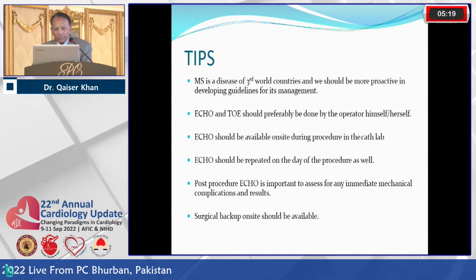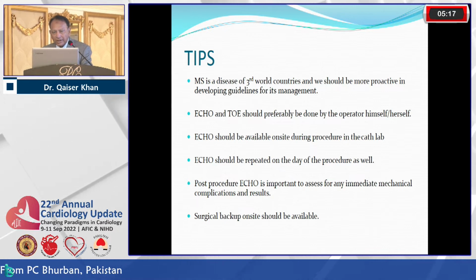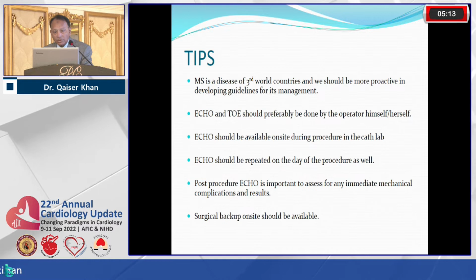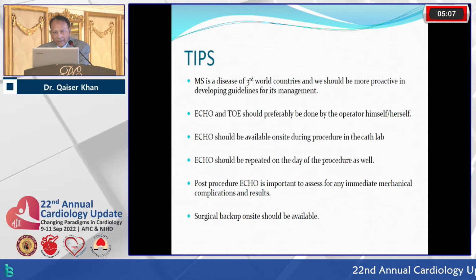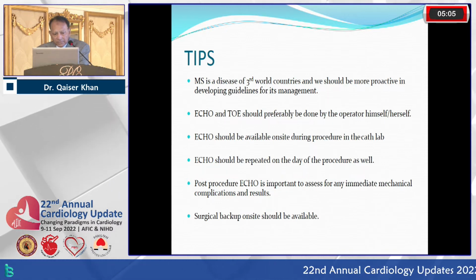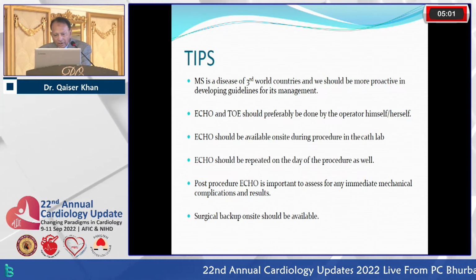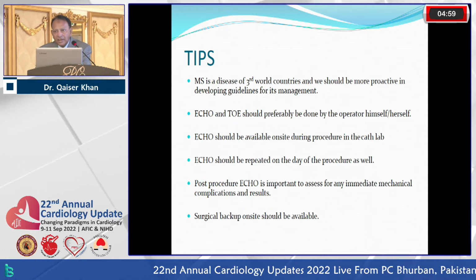Echo and TOE should preferably be performed by the operator himself or herself. The one who is going to do the procedure should do it himself. Echo should be available on site during the procedure in the cath lab. Very, very important. Echo should be repeated on the day of the procedure as well.